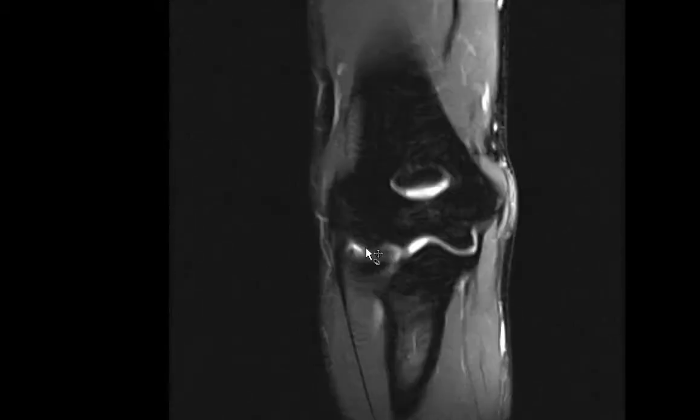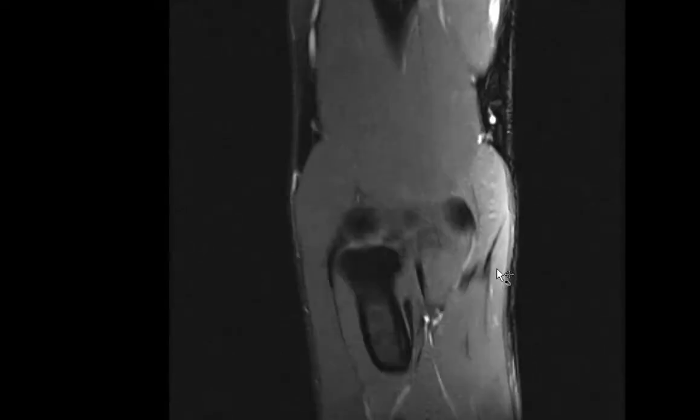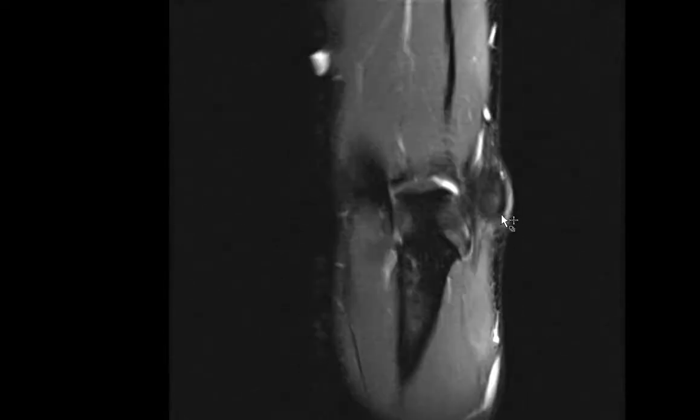The other key structures to look at on the coronal image include this dark, hypointense structure inserting onto the medial epicondyle — the common flexor tendon origin. It should be nice, black, thin, and hypointense, inserting completely onto the medial epicondyle. If this tendon becomes thickened, shows heterogeneous signal, or has T2 hyperintense signal within its substance suggesting partial tearing, that can be seen in medial epicondylitis or golfer's elbow. These can completely tear as well, but more commonly you'll see tendinosis and partial tearing. Here this is a totally normal tendon.